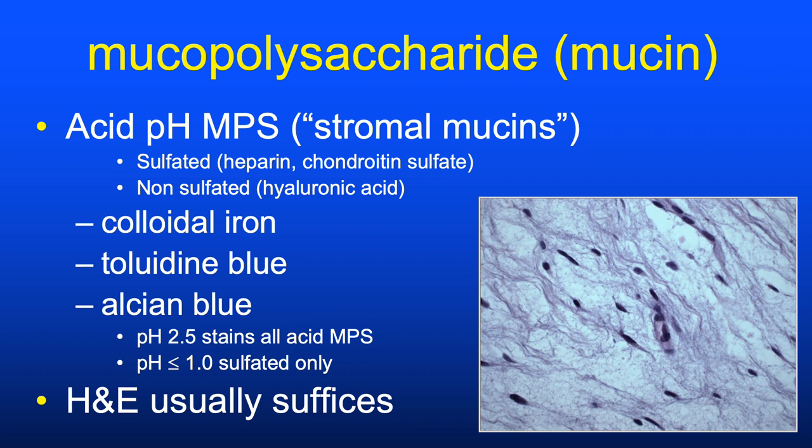Interstitial mucin has a distinctive appearance: pale blue, gray, lavender—a delicate cobweb-like appearance, often the same color as elastotic fibers but with a different pattern, and often extending into the deep dermis.